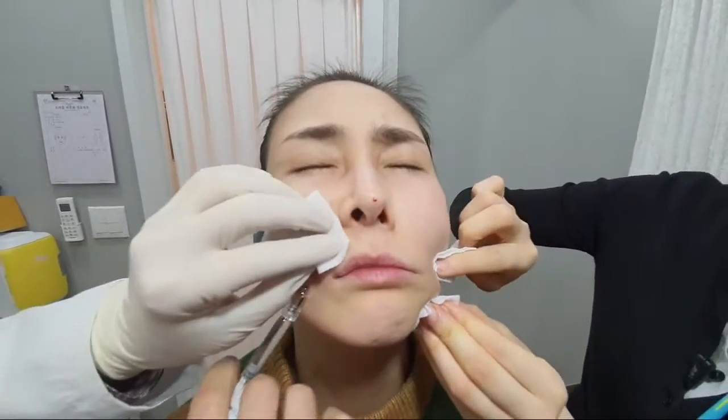You have to always be cautious that when you're inserting the filler, when you're making the injection, you don't put too much pressure on it. Ease the injection into the patient.